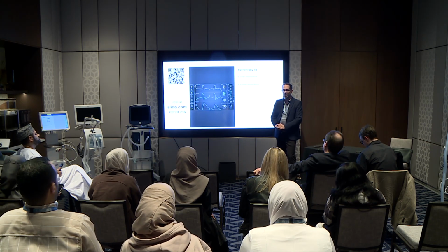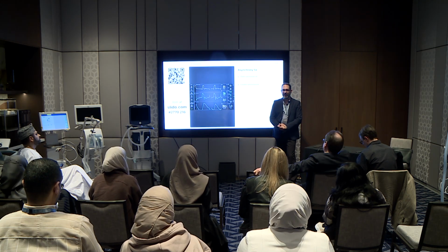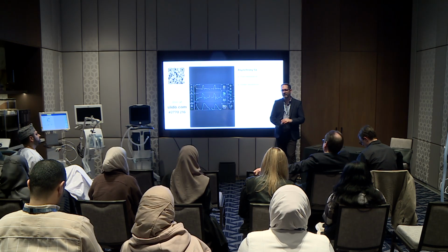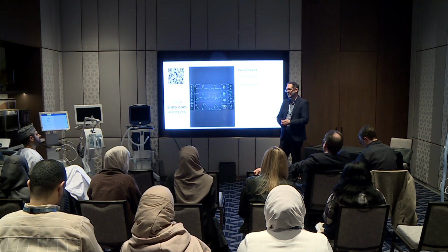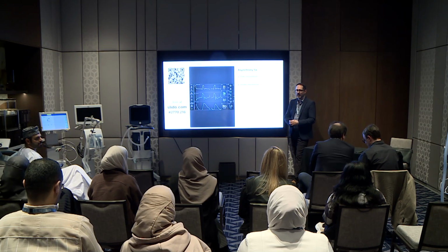There are computer programs now. There's a software called BetterCare, which does very well at identifying these asynchronies. We helped validate their algorithm for reverse triggering, and it's very, very good. It is commercially available, but it's being used mostly for research at this point, but it will identify all of these things without esophageal pressure. BetterCare is the software, yeah.